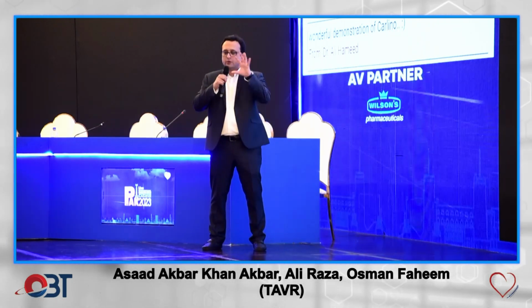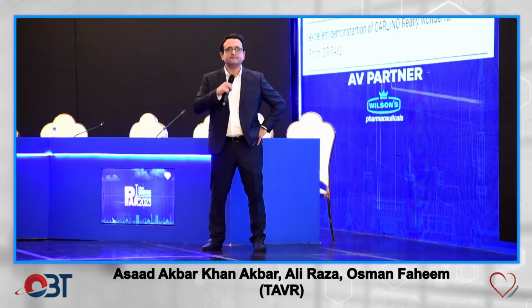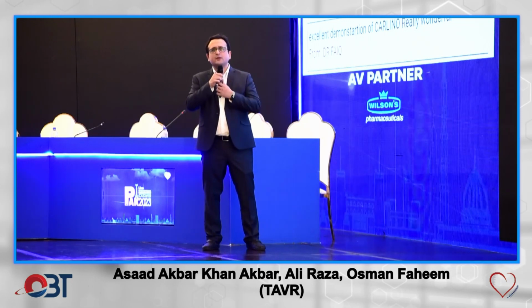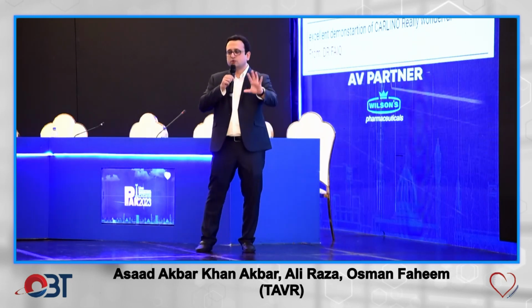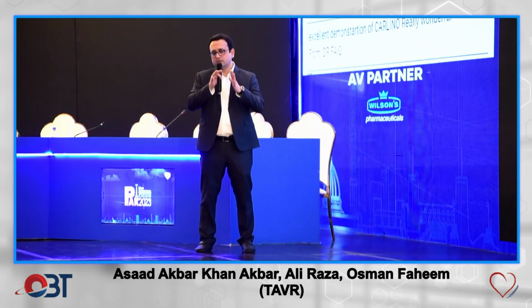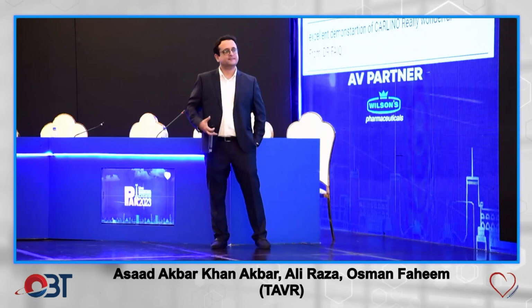You're going to do all your other homework before it, but you're just going to go up and deploy with it. और उसके अंदर it's better you pass the sheath first instead of going straight with the valve, so you make sure that there's no obstruction to it, and it also stretches the vessel a bit before you go up with the inline sheath.